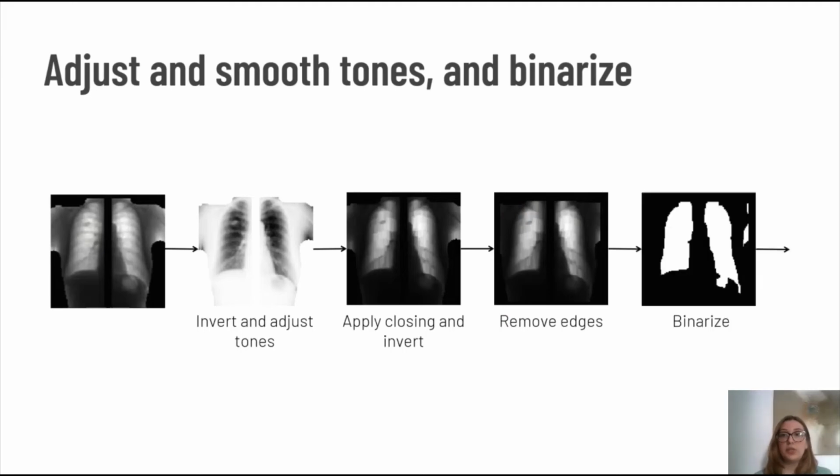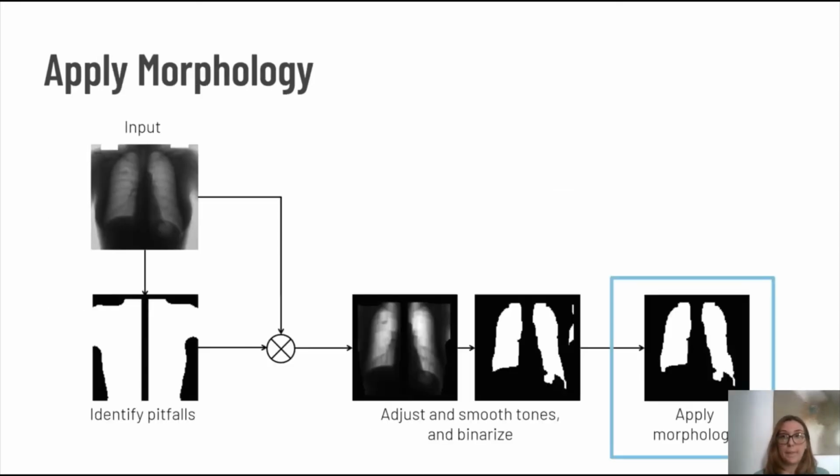Finally, the image's binarization task is done through local adaptive thresholding, in which each pixel receives a threshold value based on the sum of its neighborhood values weighted by a Gaussian window. After binarization, some remnants outside of the region of interest are still visible, so we apply some morphological techniques to remove that noise.